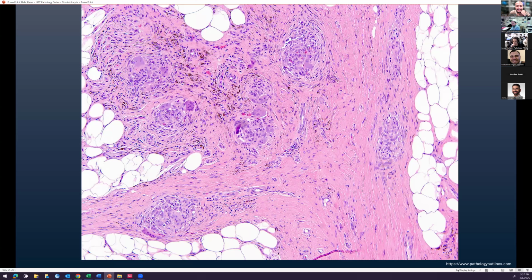So it's important that you guys get the gist of what plexiform even means. This is not my picture; it's from PathologyOutlines, so credit to Dr. Daner for this. But what we do notice here is that there are nodules of histiocytoid cells with giant cells and intervening fibrous stromal tissue, right? So that's exactly what describes at least one look for plexiform fibrohistiocytic tumor.